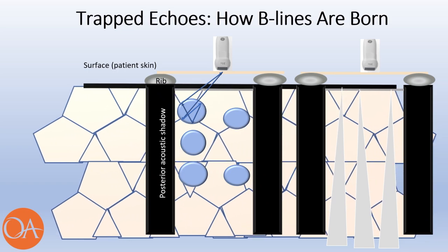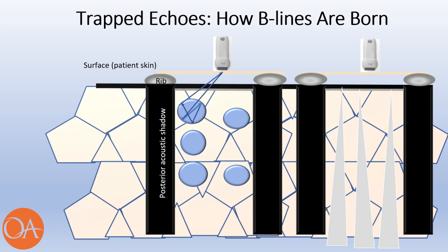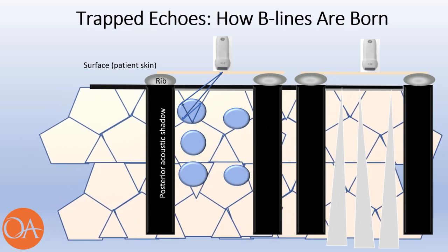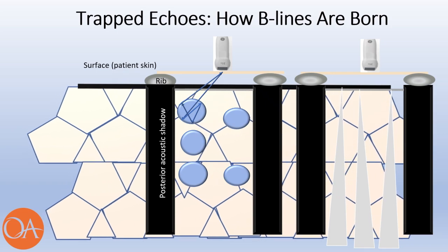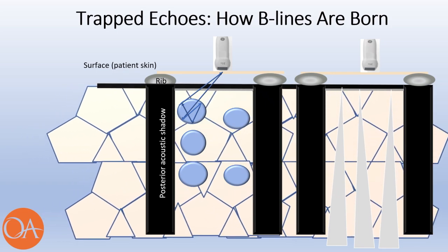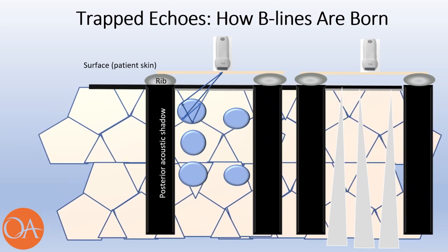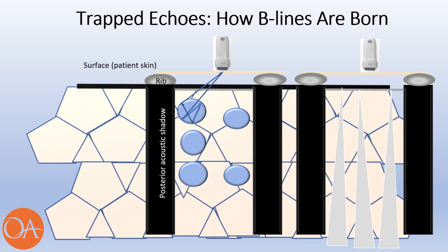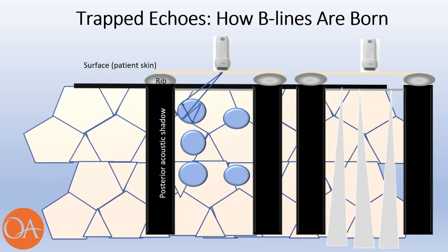These tissue-dense or fluid-filled regions create acoustic traps that give rise to continuous reverberations. One proposed mechanism is that when fluid becomes trapped within a tetrahedral configuration of air bubbles, the ultrasound waves reflect infinitely within this microstructure, generating a persistent vertical echogenic line. The accompanying diagram visually illustrates this phenomenon.